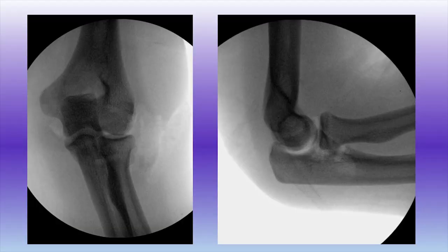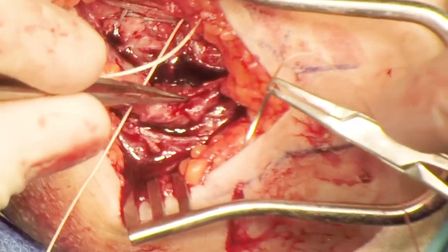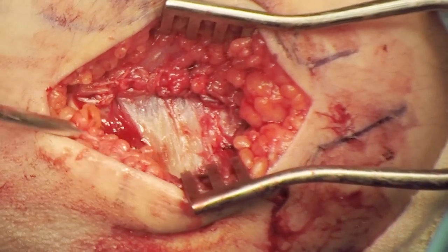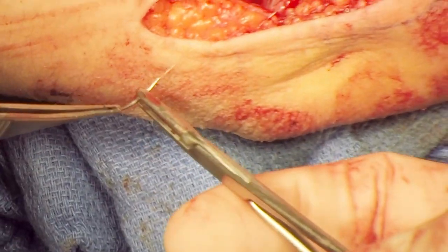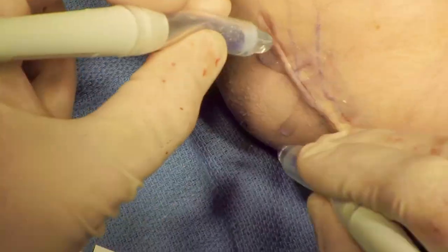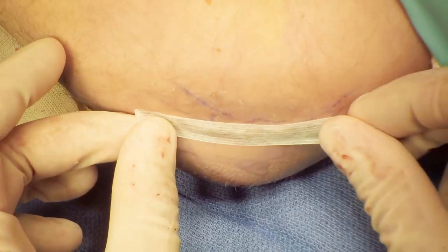Intraoperative fluoroscopy demonstrates a concentric reduction of the joint. The fascia is closed with a Vicryl suture. The skin is closed with an interrupted, buried, sub-Q, 3-0 Monocryl suture, Dermabond, and Steri-Strips.